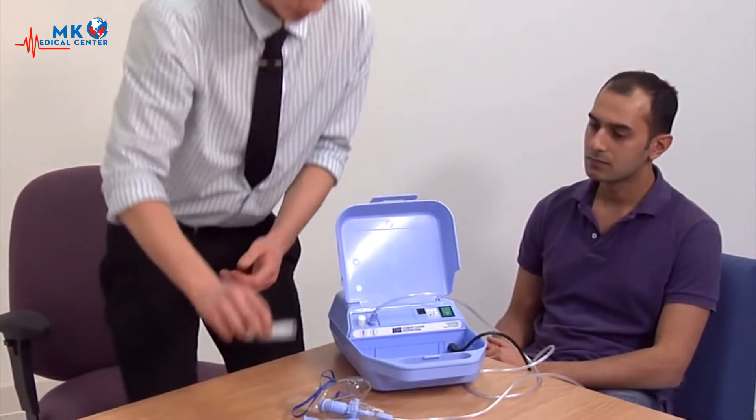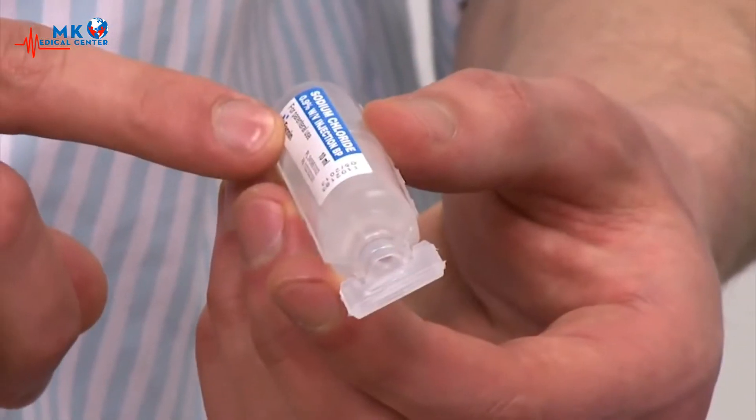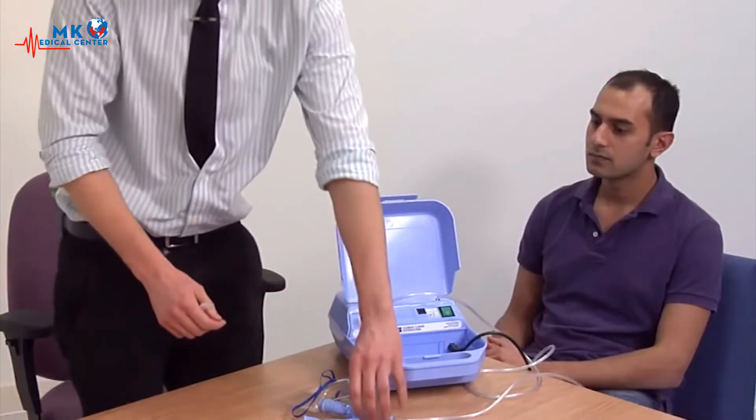Check the label and expiry date of the saline to be used, then open the nebuliser chamber and deposit the saline.